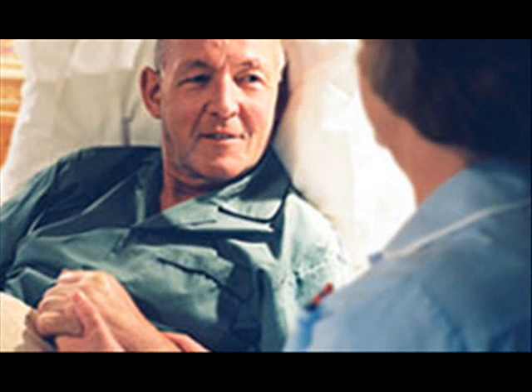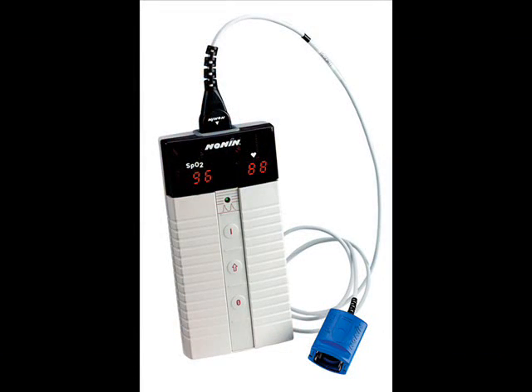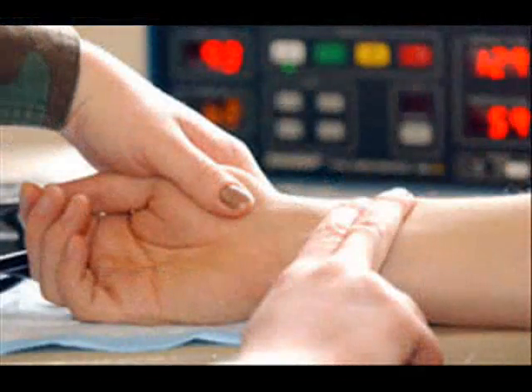It is at this point that you can explain the procedure and confirm patient understanding as appropriate to the patient's condition. The pre-assessment phase may begin, which may include pulse oximetry, auscultation, pulse check, and respiratory rate check.